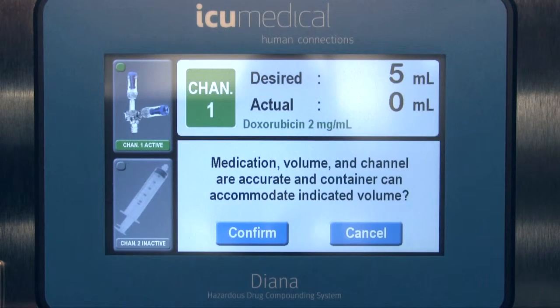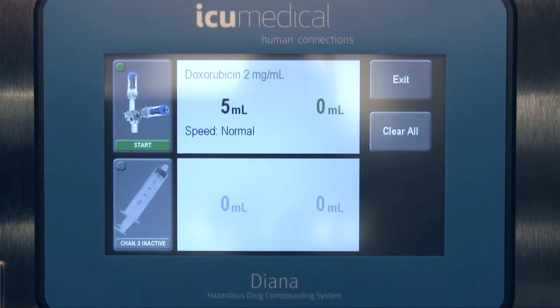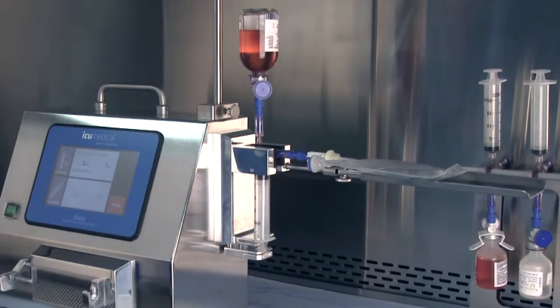At this point, the Diana system will display a confirmation screen asking you to verify that the correct medication, volume, channel, and patient container are being used and that the preparation matches the patient order. Once confirmed, press Start and Diana will automatically initiate the closed drug transfer process.